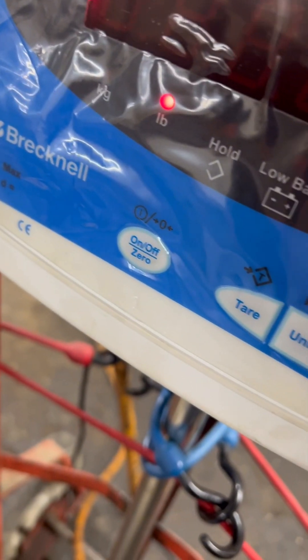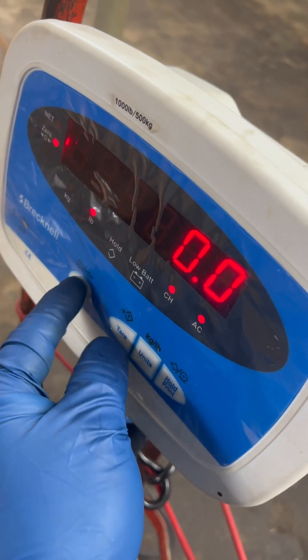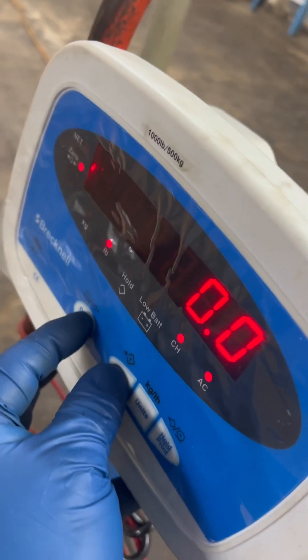So this is how you're going to test the calibration of the Brecknell SBI-100. Basically, you're going to push and hold the on and off key and the tare key together.